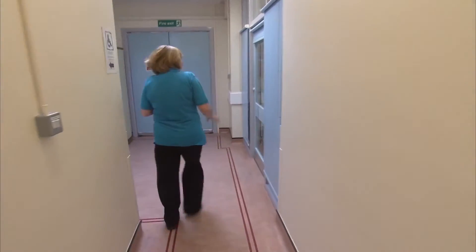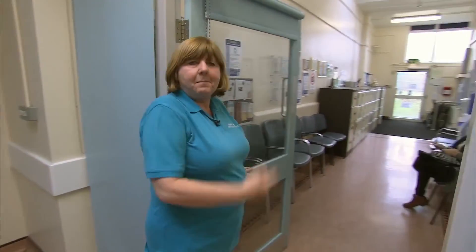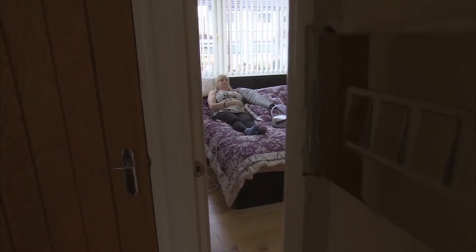Your therapist will be keeping an eye on you. So how have things been? No sign of infection — everything is brilliant. Because this sort of activates the fluid a bit, sometimes that also activates an infection. Sian has had infections occur after using the machine before, so she knows what to look out for and when it's coming on. She goes straight on antibiotics and we leave it for a few weeks. We don't mind machines as long as they do what they say they're going to do — it takes a lot of time off the therapist. Machines have their own place in the lymphedema service.